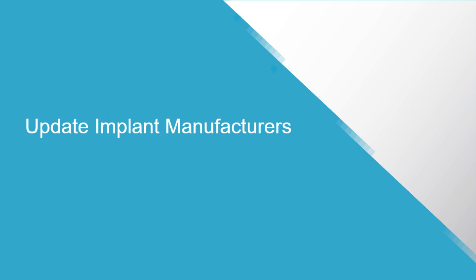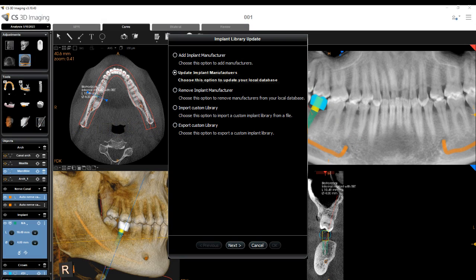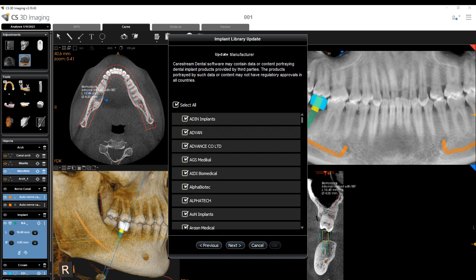Update Implant Manufacturers: Select Update Implant Manufacturers and click Next. A list of implant libraries available to update is displayed.